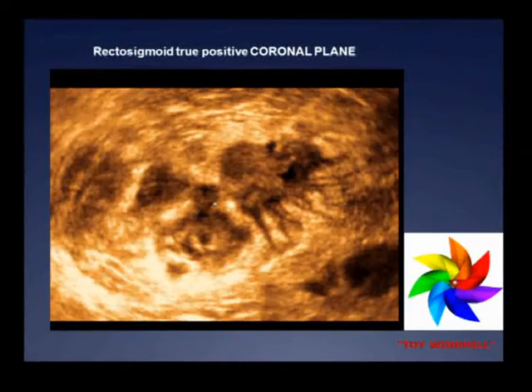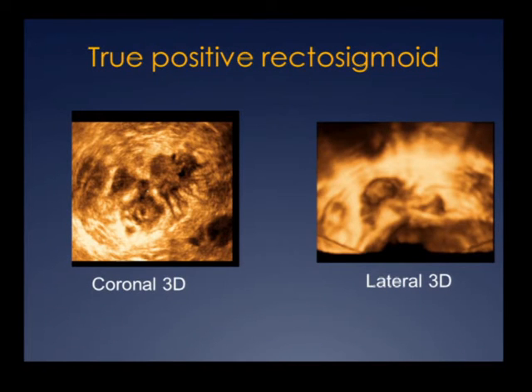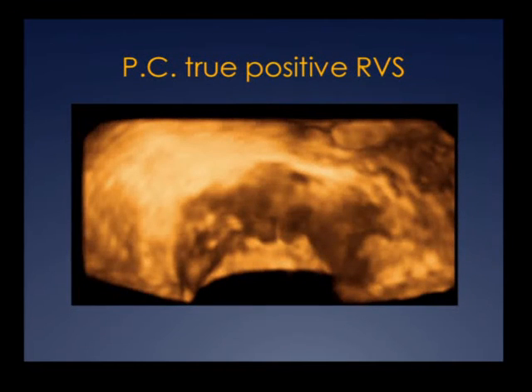And this is a typical reaction like this with a lot of retraction, and this is like a toy windmill in English translation. This is a lot of retraction all around, similar to the coronal plane using, for example, mammary glands and other kinds of 3D images. This is a totally unusual image for us. It is a new image. This coronal plane and this is the lateral plane of the same nodule. It's a completely different aspect.